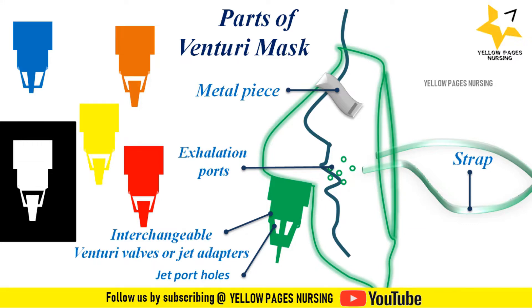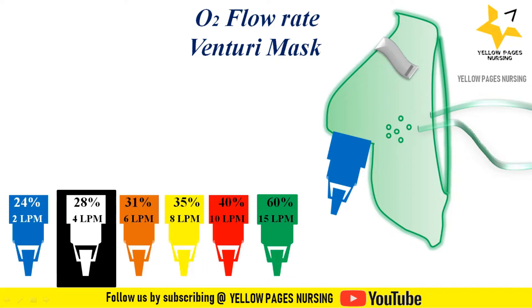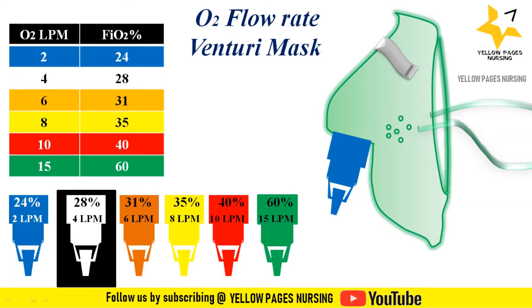Oxygen flow rate with Venturi mask: each colored valve supplies a specific oxygen concentration and flow rate. Blue supplies 24% FiO2 at 2 liters per minute. White supplies 28% FiO2 at 4 liters per minute. Orange supplies 31% FiO2 at 6 liters per minute. Yellow supplies 35% FiO2 at 8 liters per minute. Red supplies 40% FiO2 at 10 liters per minute. Green supplies 60% FiO2 at 15 liters per minute.